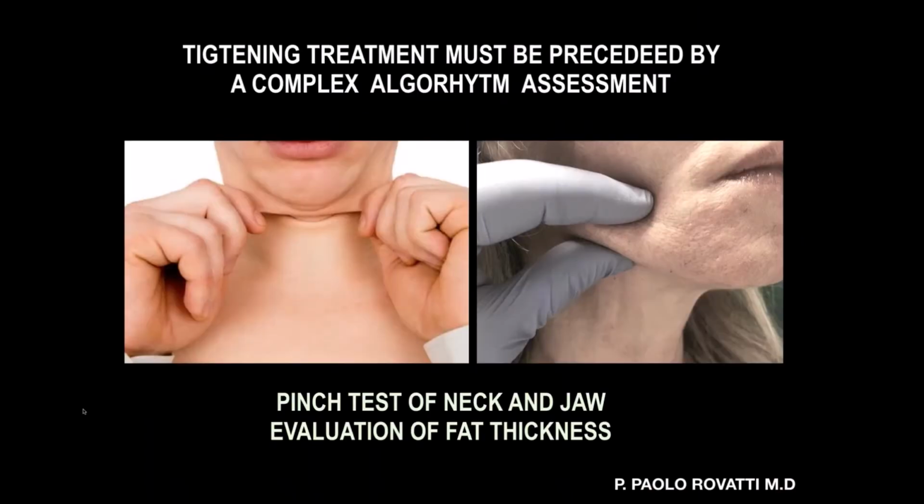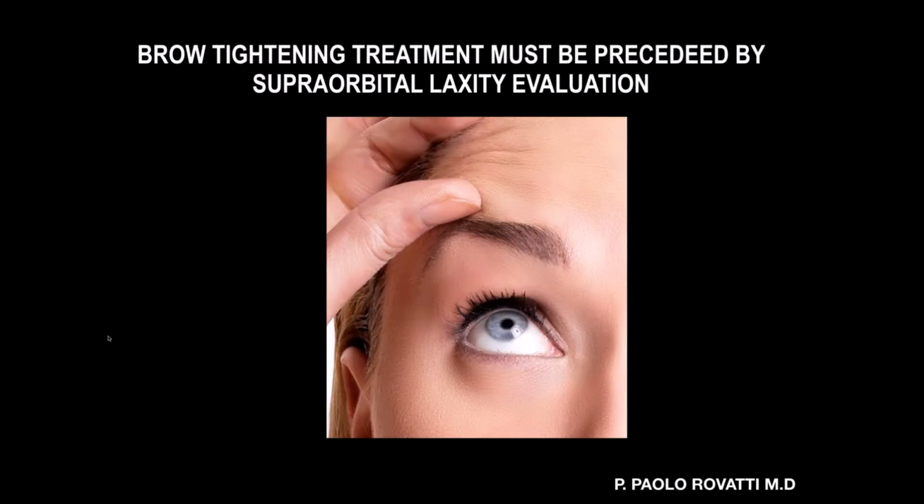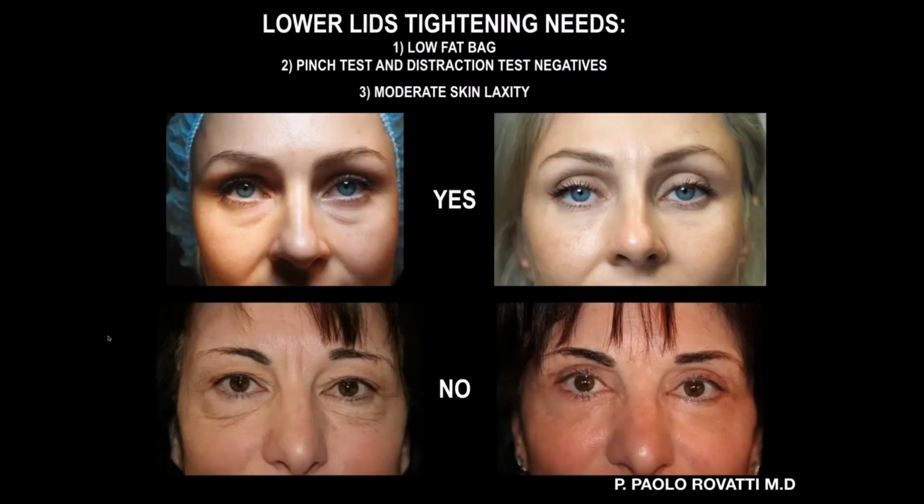Tightening is a great problem. Sorry for the mistake. Tightening treatment must be preceded by a complex algorithm assessment. So we need a pinch test for neck and for the jaw to evaluate the fat thickness. For the brow, treatment must be preceded by a supraorbital laxity evaluation, so we can see if it's a good treatment for this one. For the lower lids, tightening needs low fat bags, pinch test and distraction test negatives, and a moderate skin laxity.